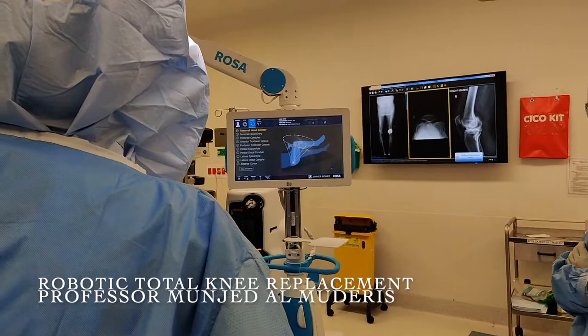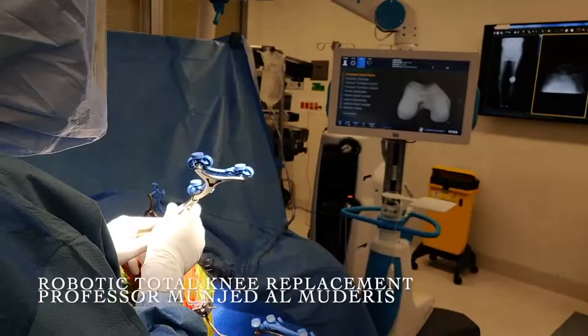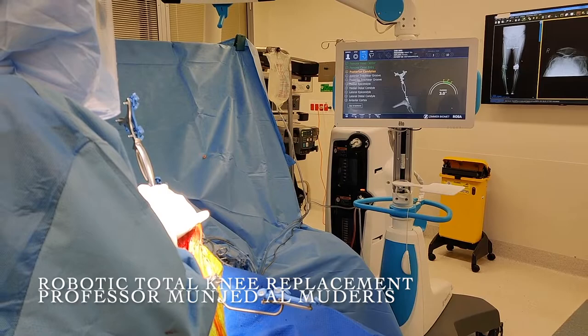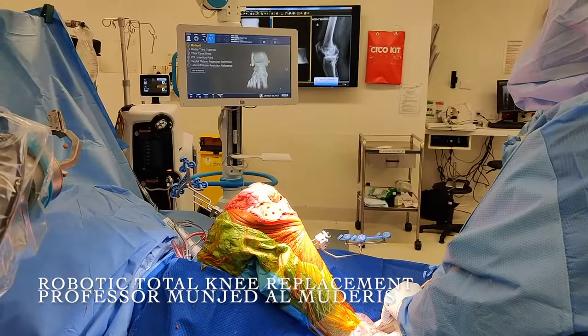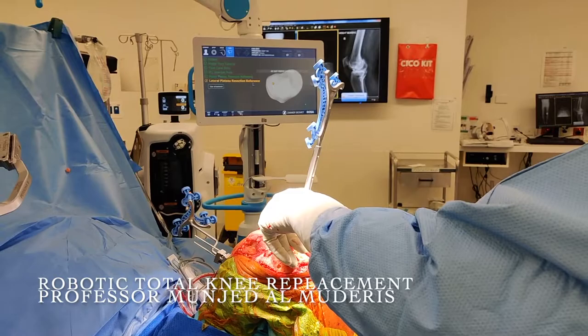The first step is to identify the center of rotation at the hip joint, with 14 points to mark. Next, I identify surface markers on the knee joint including the distal end of the femur, the anterior notch, the center of the femur, the medial epicondyle, the lateral epicondyle, the anterior surface of the femur, the medial malleolus, the lateral malleolus, the tibial tubercle, the ACL insertion, the PCL insertion, the medial tibial plateau, and the lateral tibial plateau.